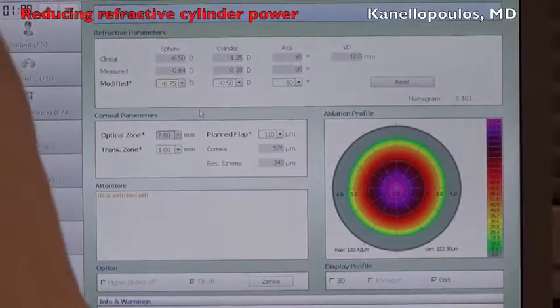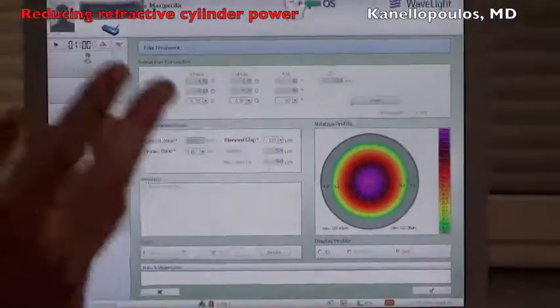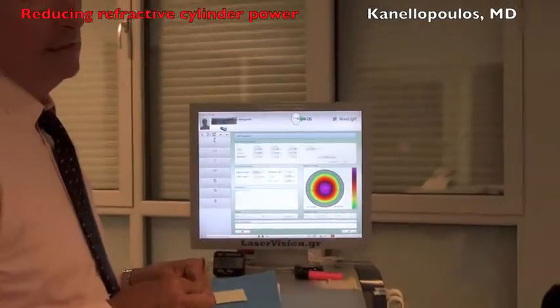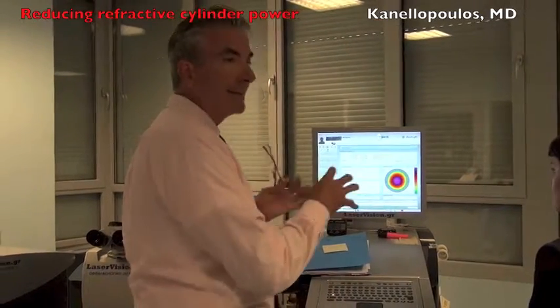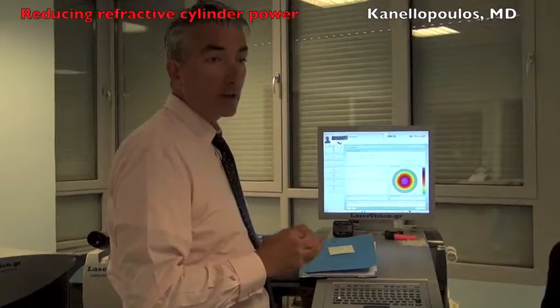So this is our technique. These are the lessons we've learned this last year from incorporating topographic guided data into refining our clinical refraction.